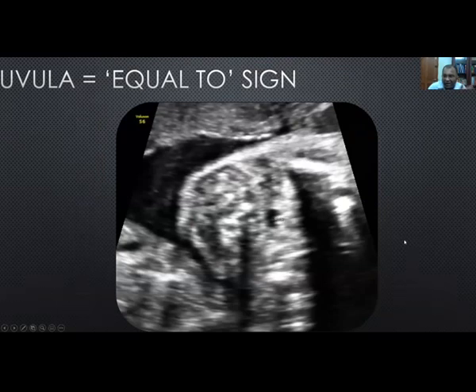and an intact uvula rules out an isolated soft palate cleft. So this can be used in every anatomy scan to seek or rule out an isolated soft palate cleft. In 70% of the cases, you will be able to see the uvula just as you keep the probe into the pharyngeal fluid. In 7 out of 10 cases, you can immediately see the uvula. In 30% of the cases, you might need to wait for the baby to swallow or take some amount of fluid around to have a good look at the uvula.